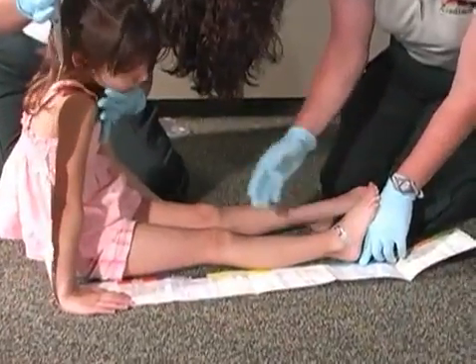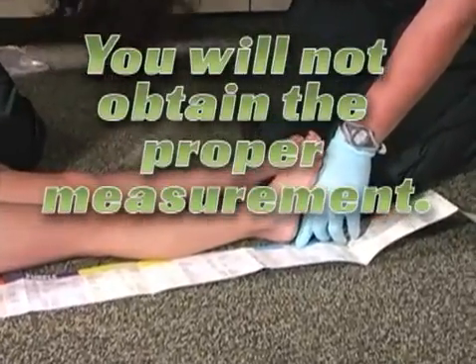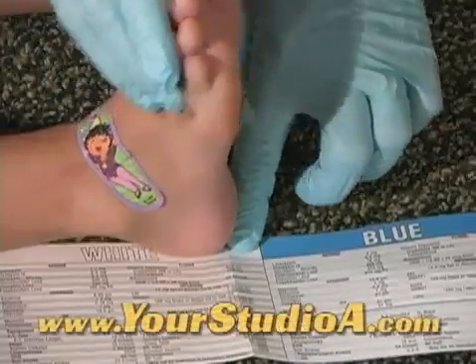Never measure a child in the seated position. You will not obtain the proper measurement. Measure to the bottom of the patient's heel, not the toes.